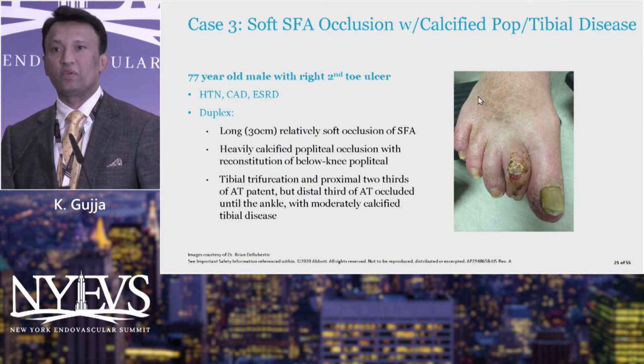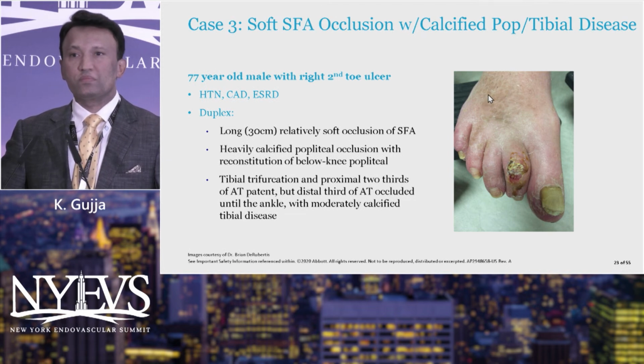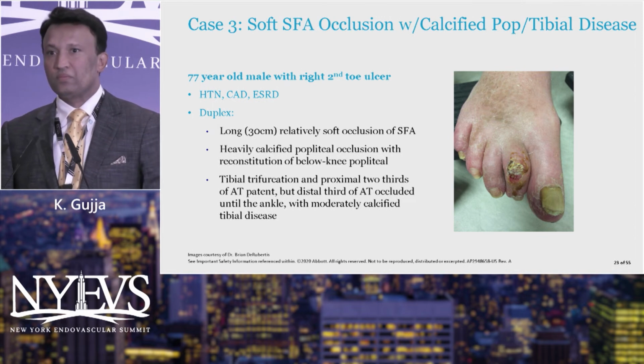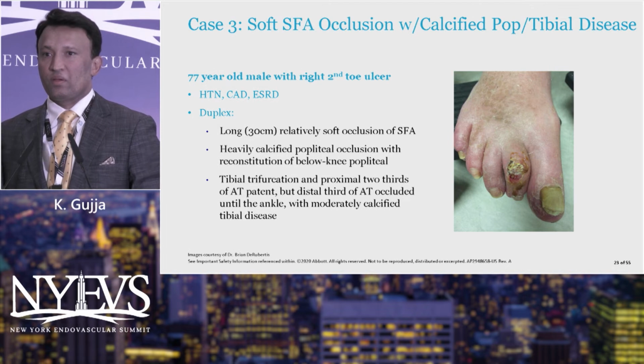So, yes. I know you've been talking about the Abbott wires, and for the coronary guys who do CTOs, what do you guys think of the Asahi Act 1 technology, and with some of their slew of wires for infrapop CTOs? What do you guys think?